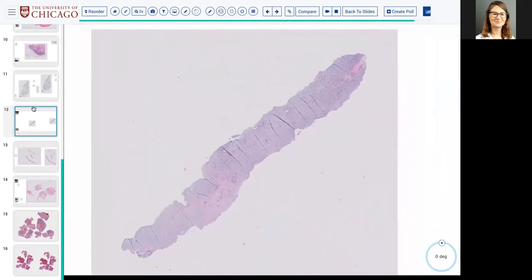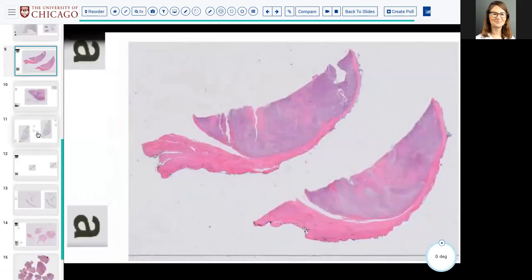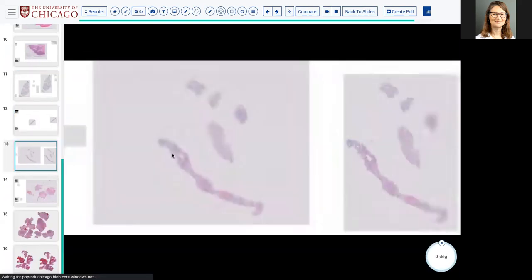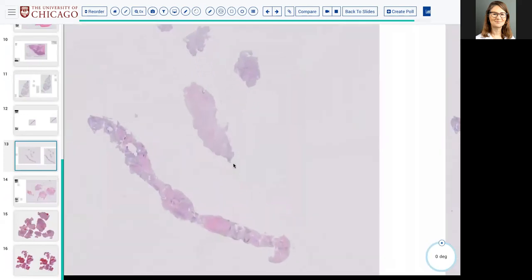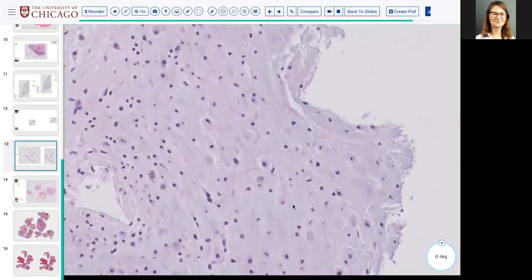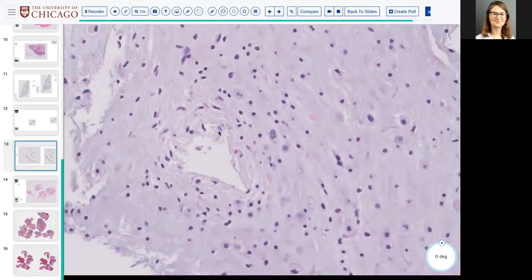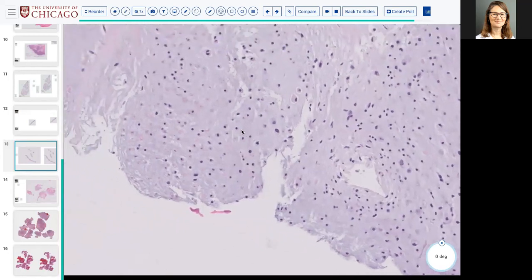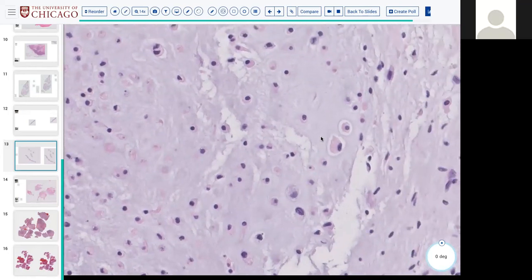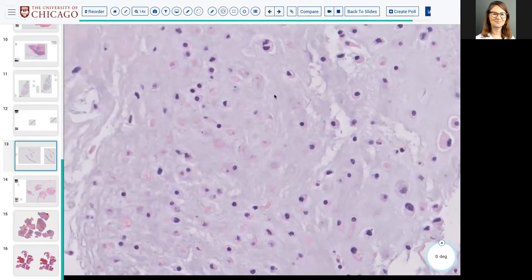All right, so we've touched on the three things that appear super morphologically similar: myoepithelial, chordoma, extraskeletal myxoid chondrosarcoma. All right, so now let's move on to this one. Oh, goody. More cells floating in a myxoid background. Are these cells touching or connecting? No, they're not even clustered. They're so spaced out in their individual little areas.